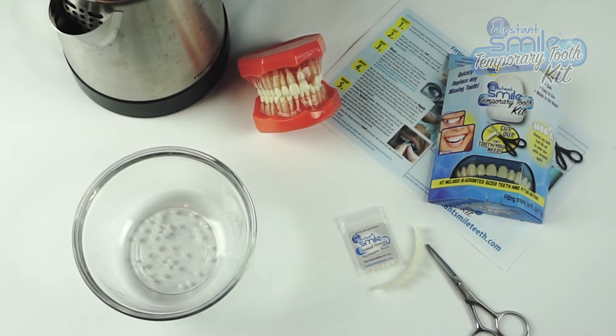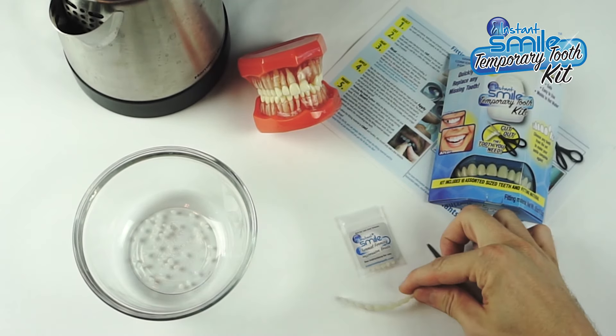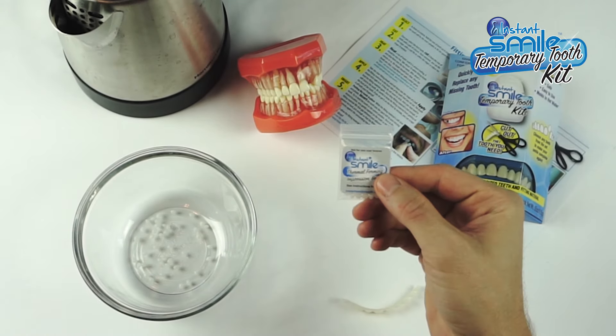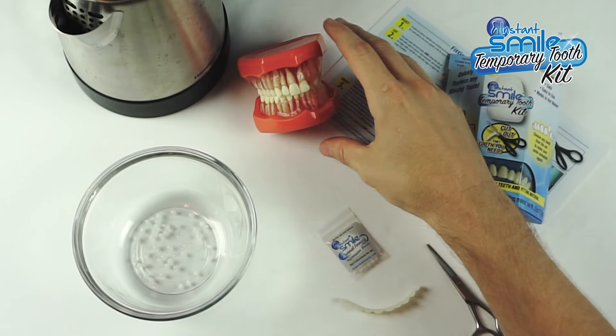This is the Instant Smile Temporary Tooth Kit. Included in the kit is a strip of molded artificial plastic teeth, a bag of thermal fitting impression beads, and some simple to follow instructions.